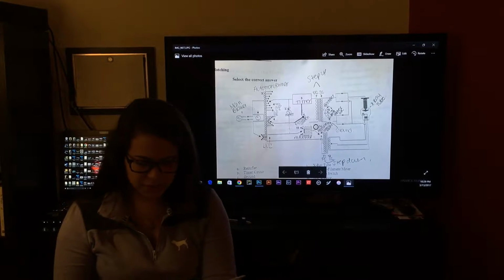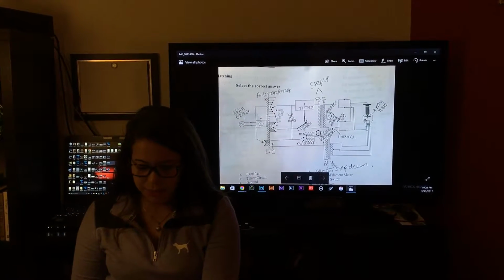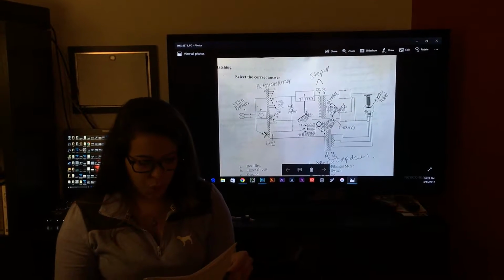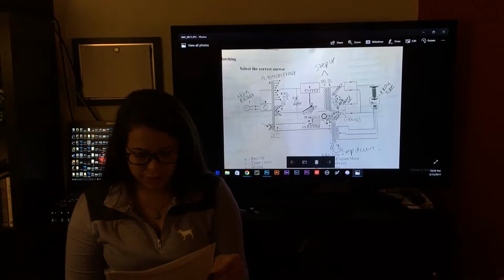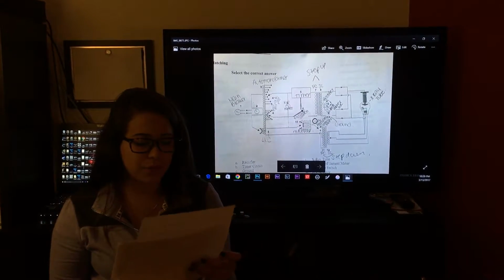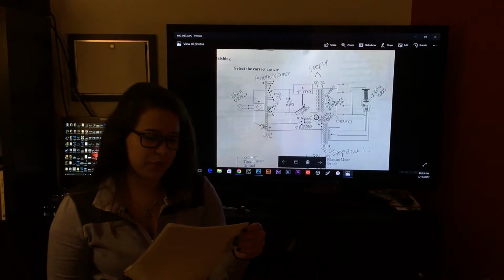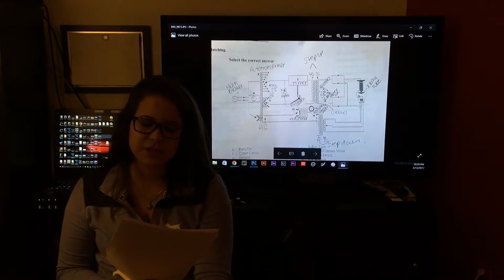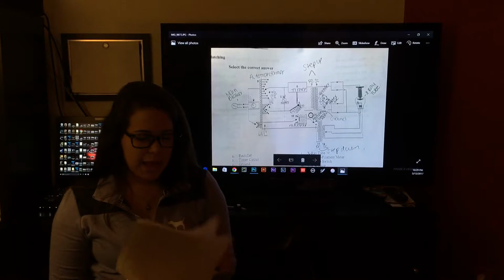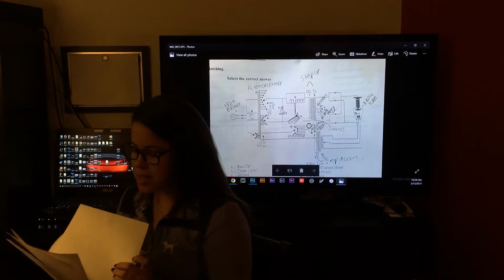If the minimum response time is longer than the amount of time needed to produce the exposure, it results in an increased amount of radiation reaching the image receptor. With pediatric patients and other patients who cannot cooperate with the radiographer by holding still or holding their breath during the exposure, AEC devices may not be the technology of choice. Okay, so that would be the AEC.